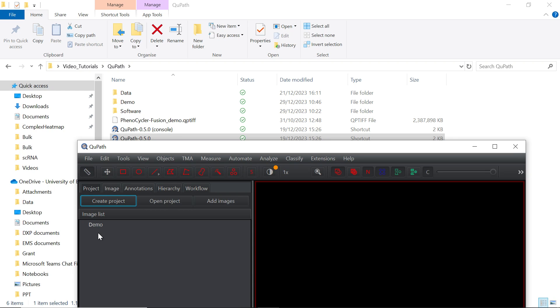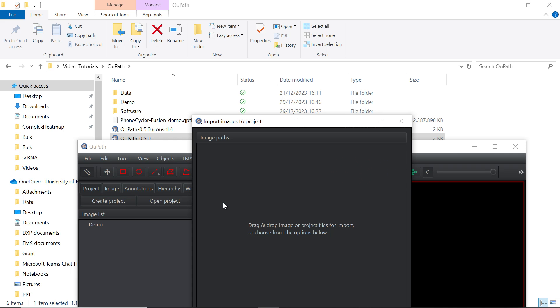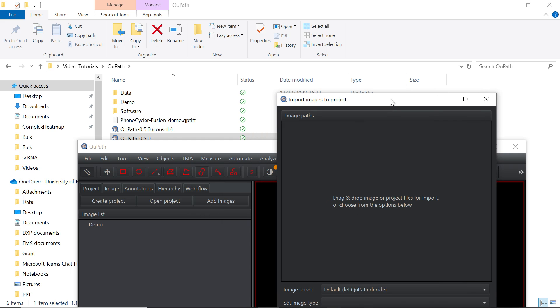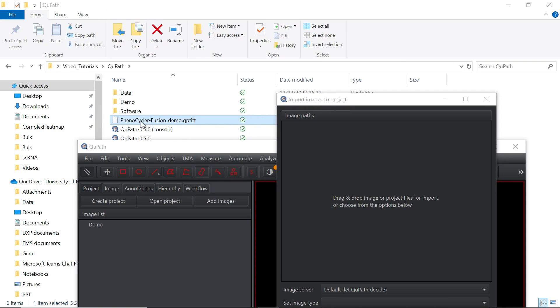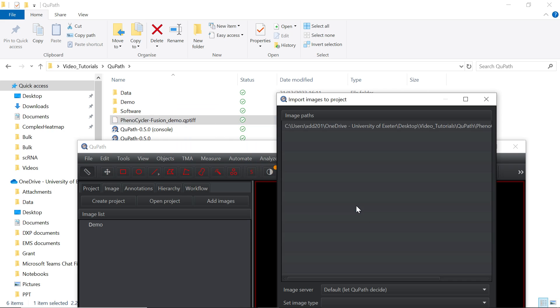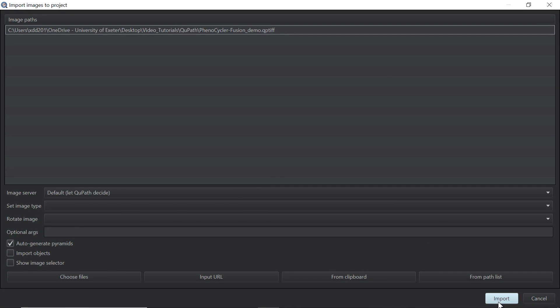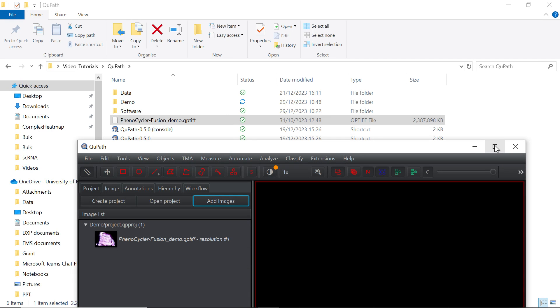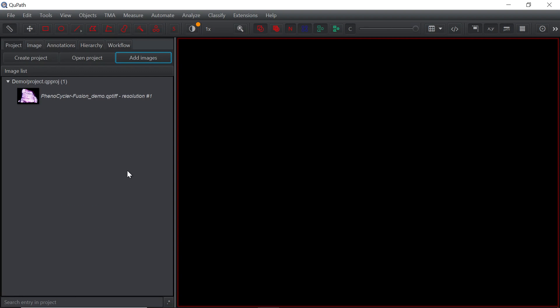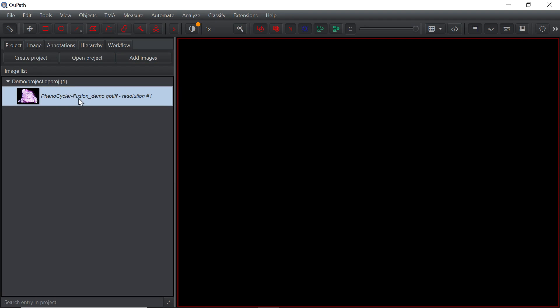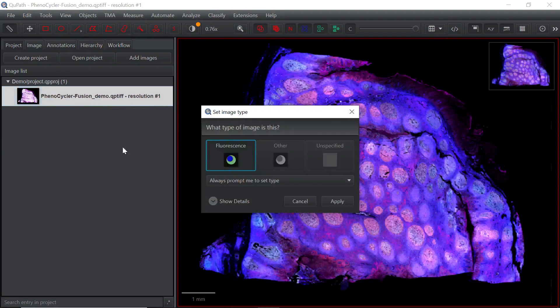Next step, we need to add images. If you click the add images button, it pops out another window where you can drag and drop the image file. Let's drag and drop the demonstration image file. You can see it shows the image path. We can click the import button to import the data. Now we have the image data here. If you double-click the image, it will load the image.